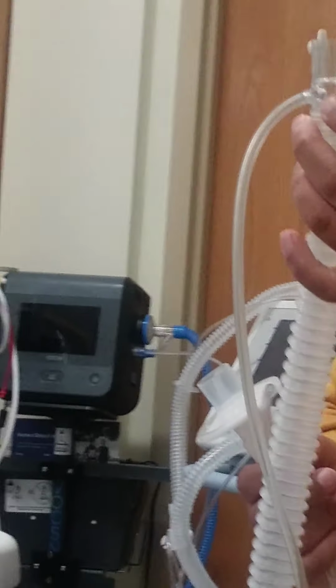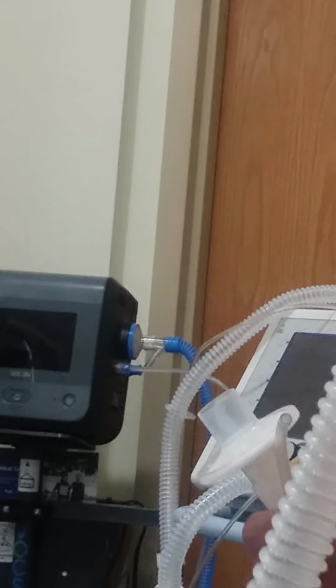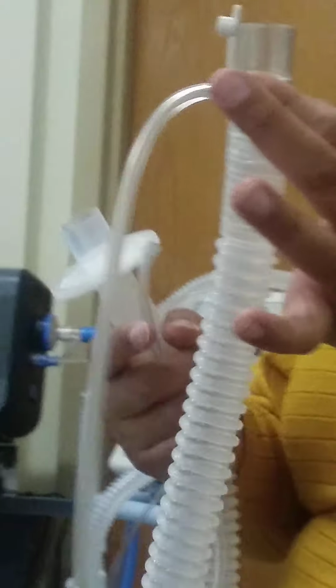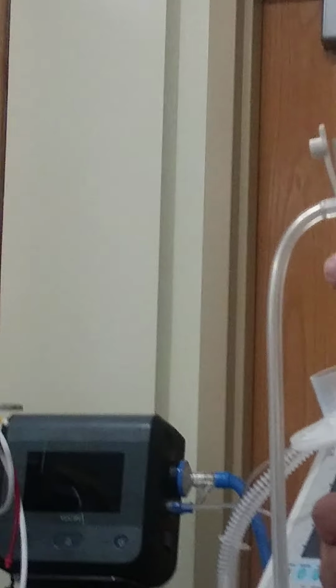There has to be some type of exhalation, because what would happen if this wasn't there? It's an exhalation valve. Yeah. Your patient there would be nothing coming out, and my patient would be rebreathing their CO2. Okay, so this is very important. So if your circuit doesn't have an exhalation port, then that's an issue. An exhalation port or valve.